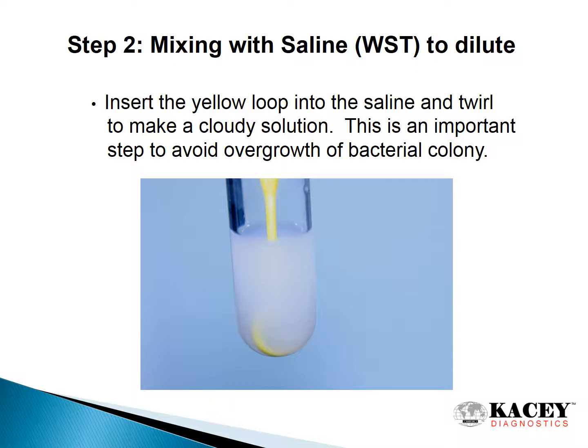Step 2. Mixing with saline, WST, to dilute. Insert the yellow loop into the saline and twirl to make a cloudy solution. This is an important step to avoid overgrowth of the bacterial colony.